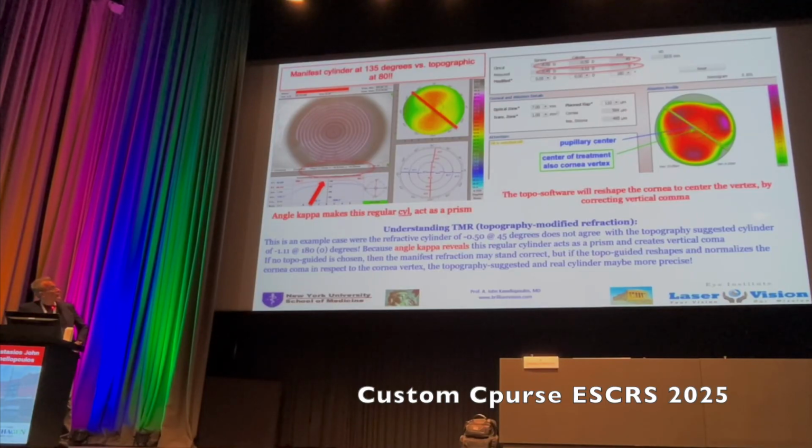Let's hear from you guys. Why do we all agree that this astigmatism is regular and with the rule? Does anybody feel that the astigmatism of this topography is irregular and not at absolutely 90 degrees, with the rule? So I guess this means nobody disagrees with this. Why is it that this patient refracts at 45 degrees and not 180?